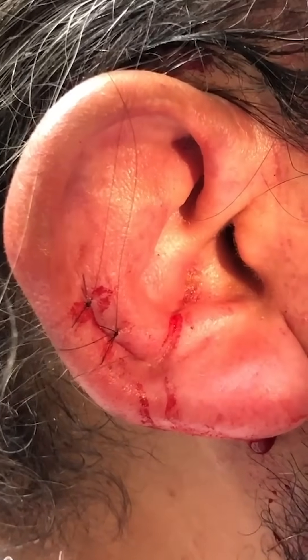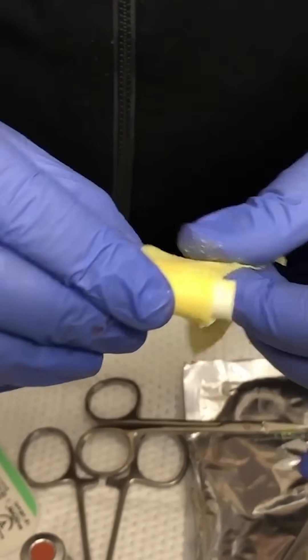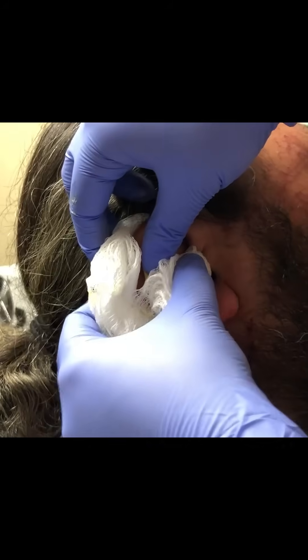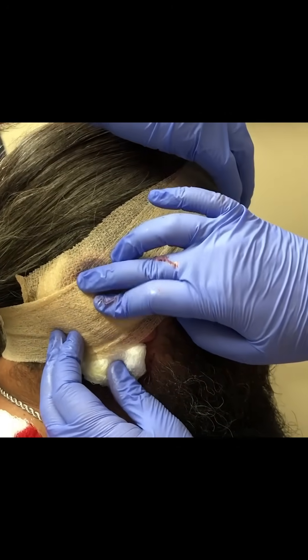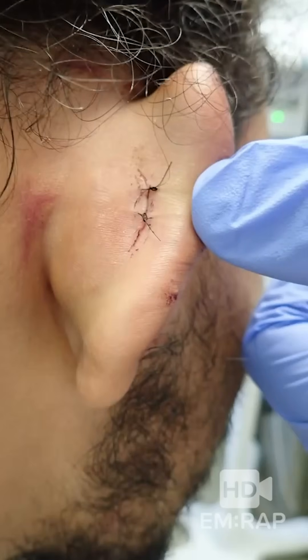The final step is the ear bolster. Take a dental roll wrapped in xeroform gauze and put that into the curvature of the ear, then some padding with fluff or 4x4s behind and on top of the ear. It's going to need to stay in place for about 7 days, and then the patient can return to have it removed and rechecked.